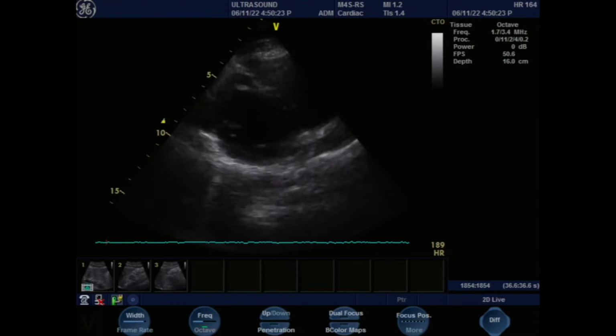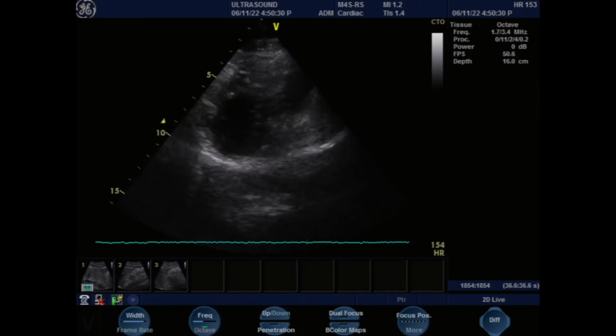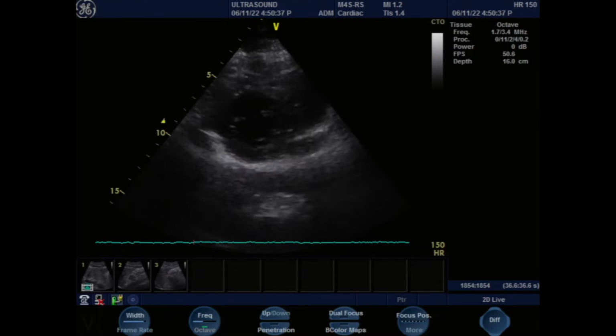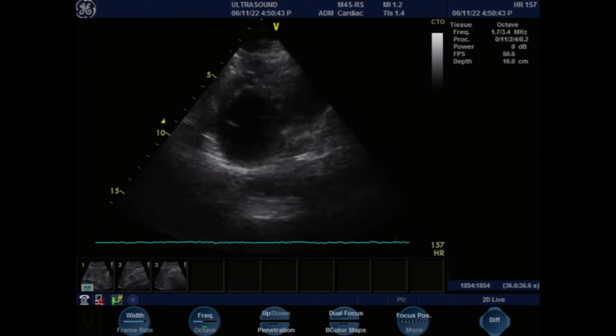We're turning here, and we find the circular heart right here. And now you can see the valve, the entire mitral valve coming into play. You see this? It's like a heart-shaped valve. You can see the two cusps of the valve. And let's see if I can bring it in focus here. So here you see both of them. This entire thing you see here is the mitral valve, the circular valve. So you see the entire orifice of the mitral valve.